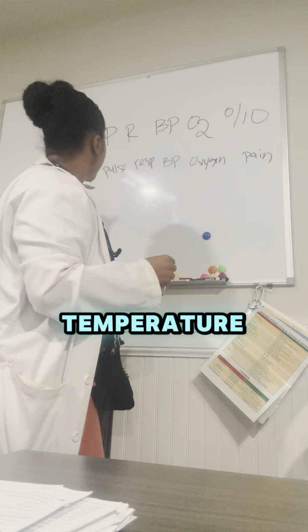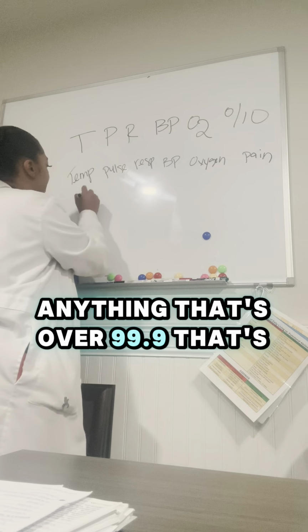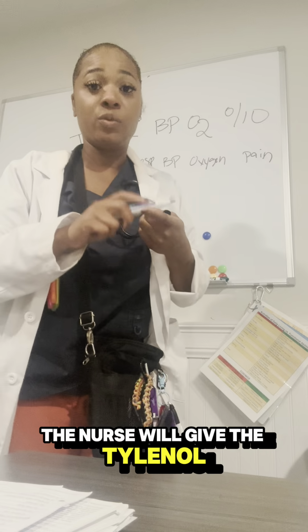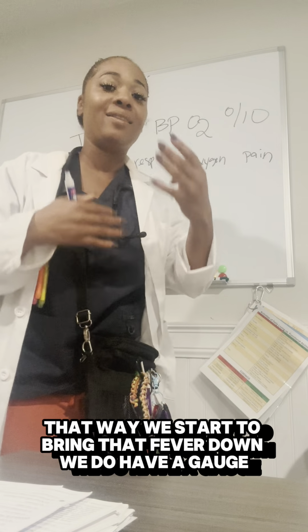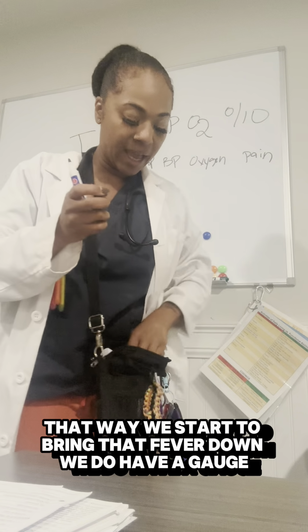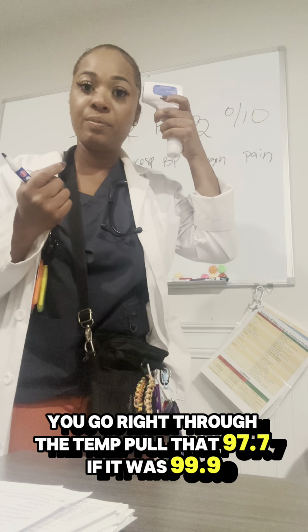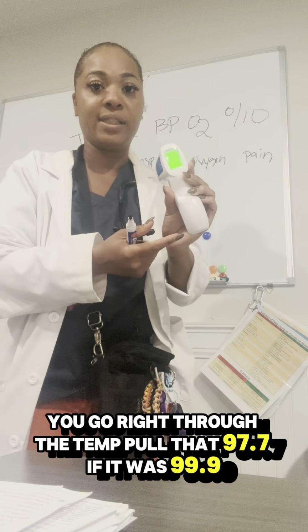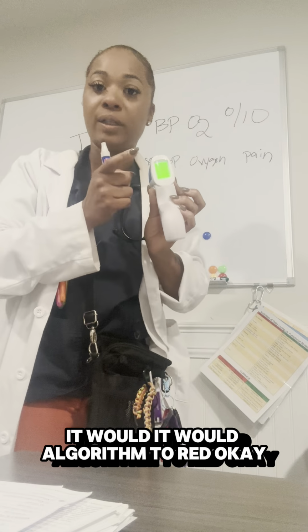So within our temperature, anything that's over 99.9, that's going to put us in a fever. You want to make sure that you give your patient, the nurse will give the Tylenol, acetaminophen. That way it will start to bring that fever down. We do have a gauge. We call this a temporal gauge. You go right through the temporal there, 97.7. If it was 99.9, it would alarm to red.